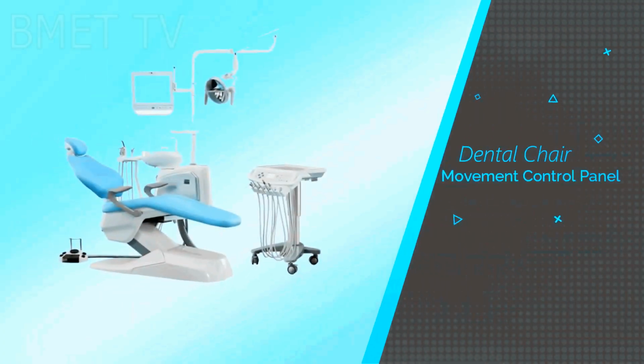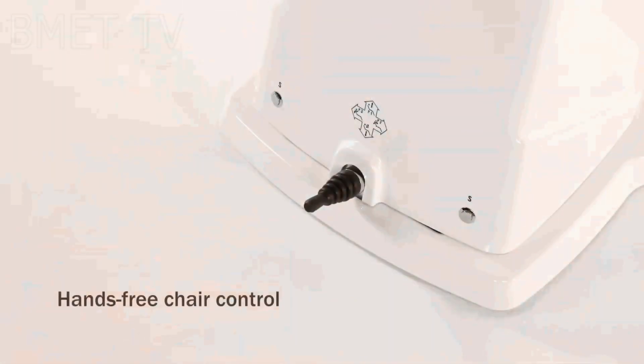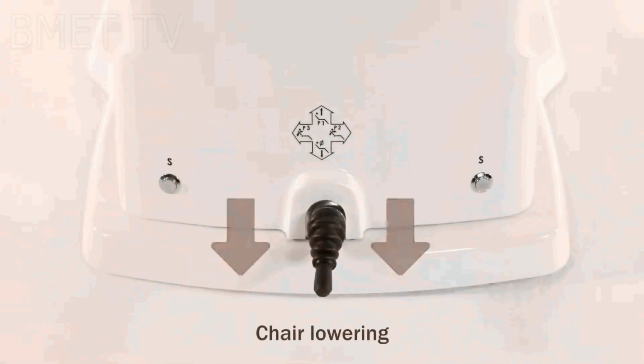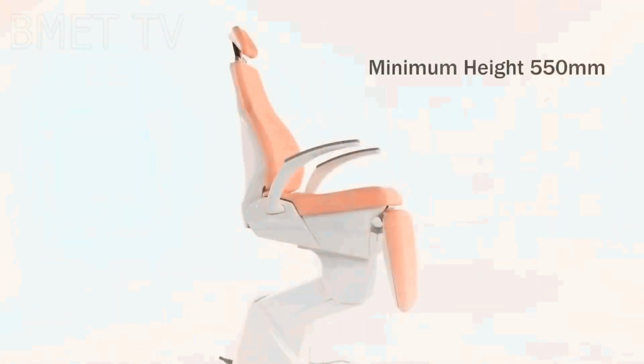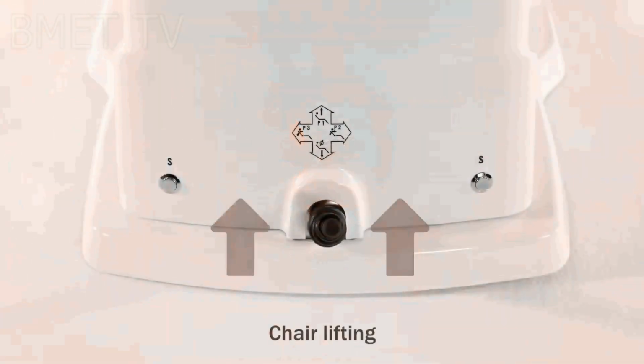The second component is the dental chair movement control panel. Dental chair controls are comprised of control buttons that can move the dental chair upward or downward depending on what is best suited for the clinician. The movements are move up, recline to rest, move down, lie down, lift, and raise the seat.